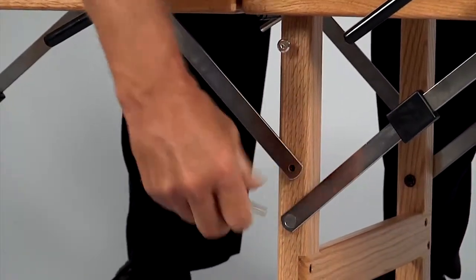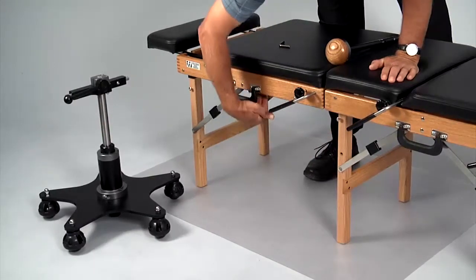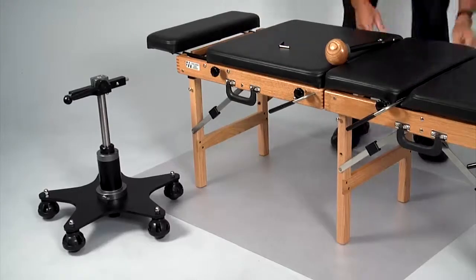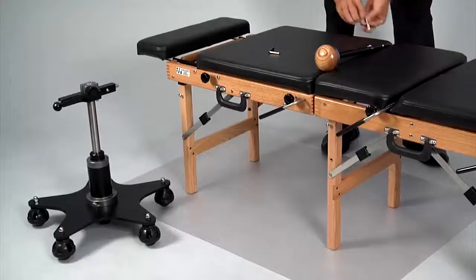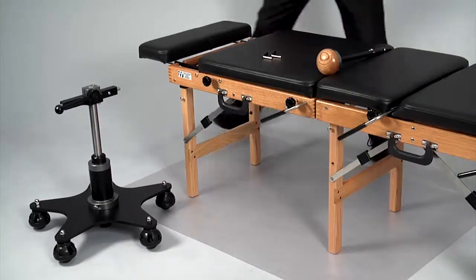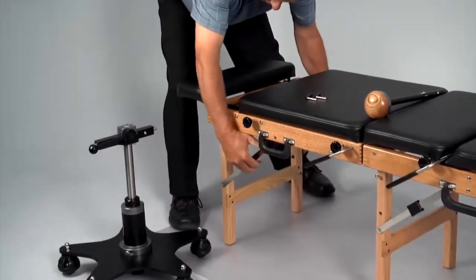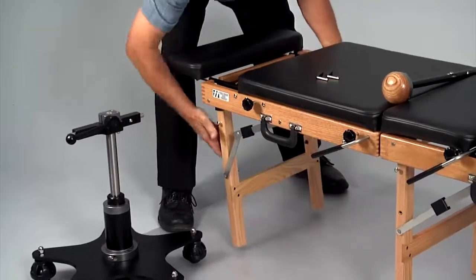To attach the flexion distraction device to your portable table, first remove both mid-leg support pins and swing up the mid-leg support braces. Set the pins aside. Slide the black hinge locks off of the hinges and fold the back legs up into the table.